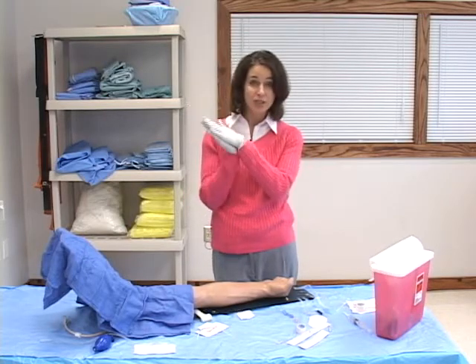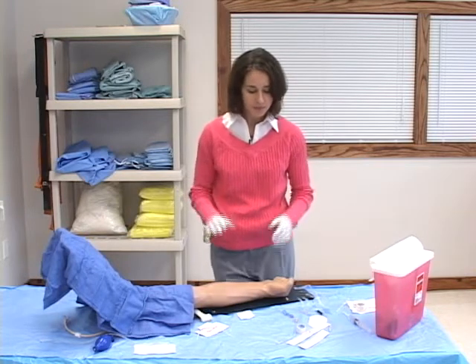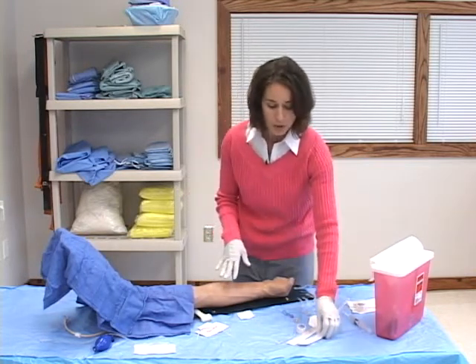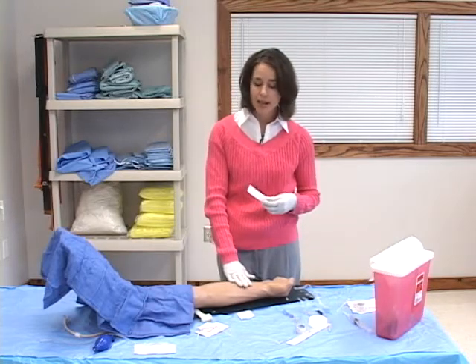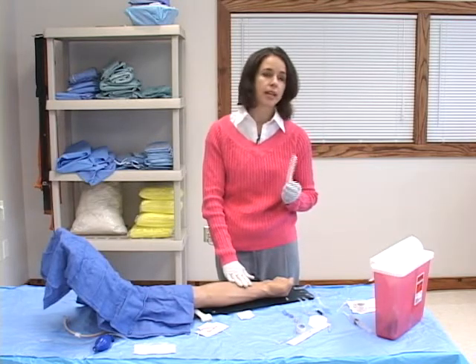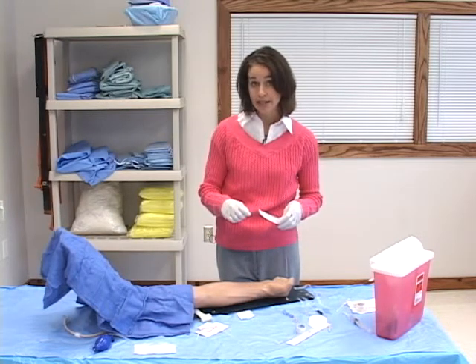So the first thing you're going to need is your gloves. You always want to use universal precautions as you would for any child. For a child, you want to choose an appropriate size catheter. This is a larger arm that we're looking at today, so I'm going to be using a 22 gauge needle. Oftentimes with a younger baby, you want to use a 24 gauge catheter.